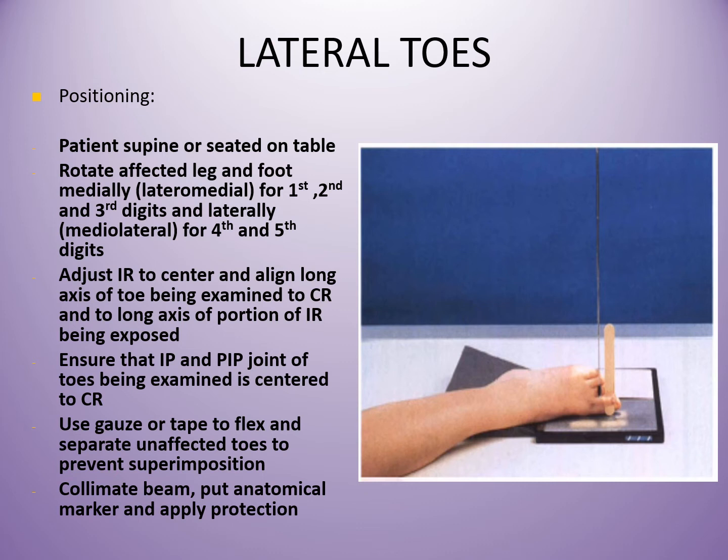Right, so just apply like this lah. Sama juga, you are more on the medial side, the second, first, until third. Okay, you can apply the medial side lah. Actually much more stable use for the medial side compared to the lateral side juga.